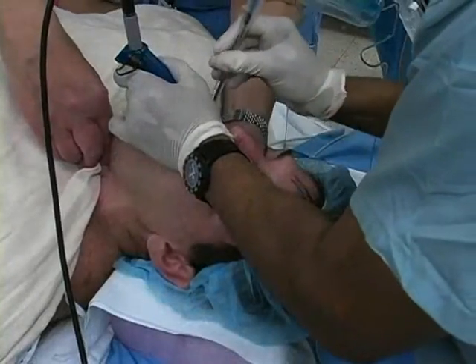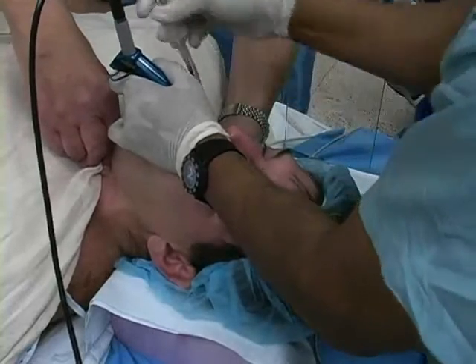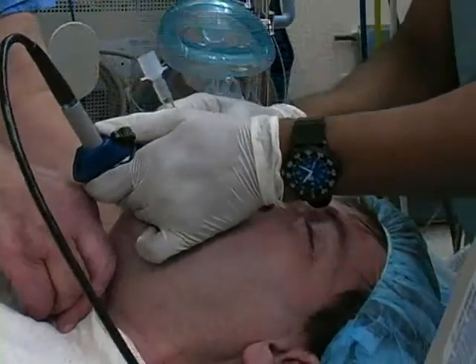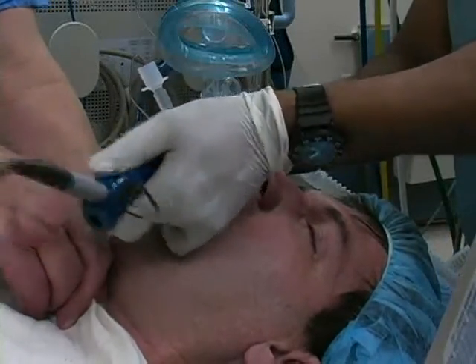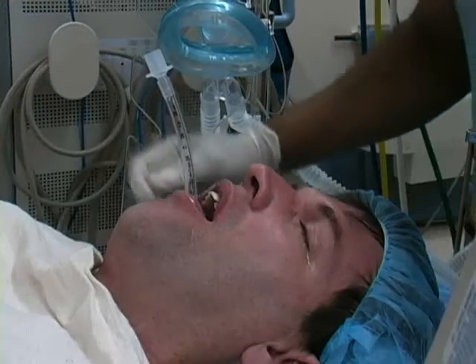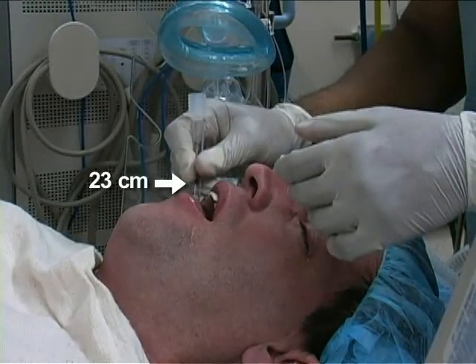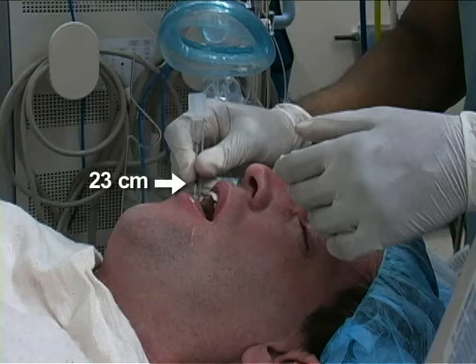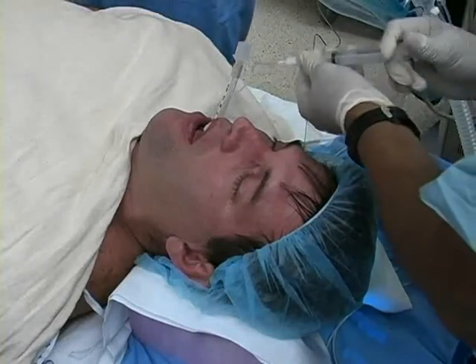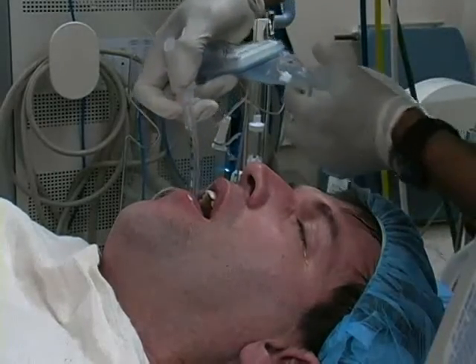After the endotracheal tube has been placed through the vocal cords, remove the stylet. Remove the laryngoscopy blade slowly, protecting the patient's teeth. Advance the tube to a depth of 21 cm in a female patient and 23 cm in a male patient. Inflate the endotracheal tube cuff with a clean syringe and connect the tube to the breathing circuit.